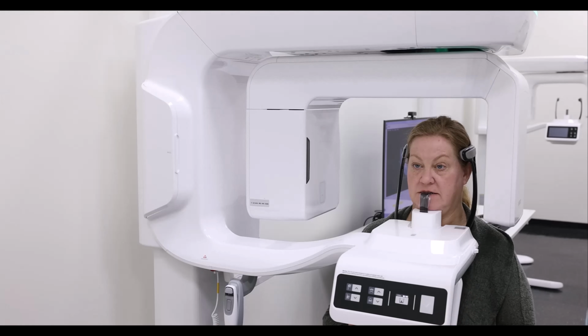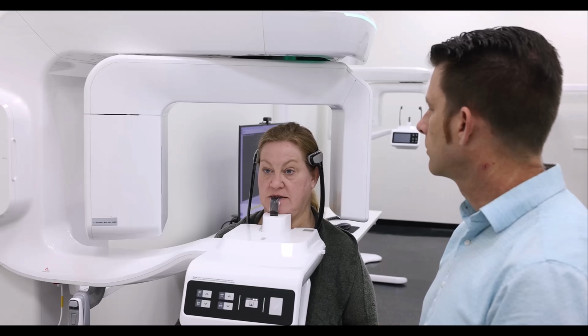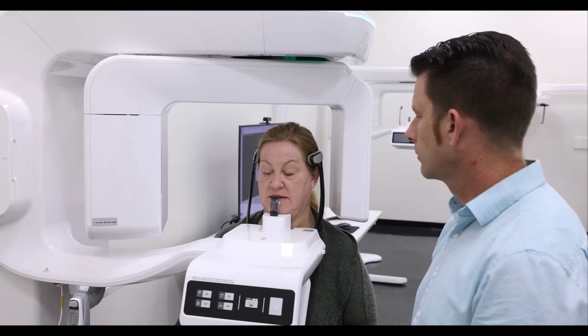The system is moving into image capturing position. Please wait. The device does provide instructions again to have the patient close their eyes. In this case with the pan, I'm going to wait until it tells the patient to close their eyes, then I'm going to go capture the image. All right. The system is ready to capture an image. Please close your eyes until image capturing is complete.